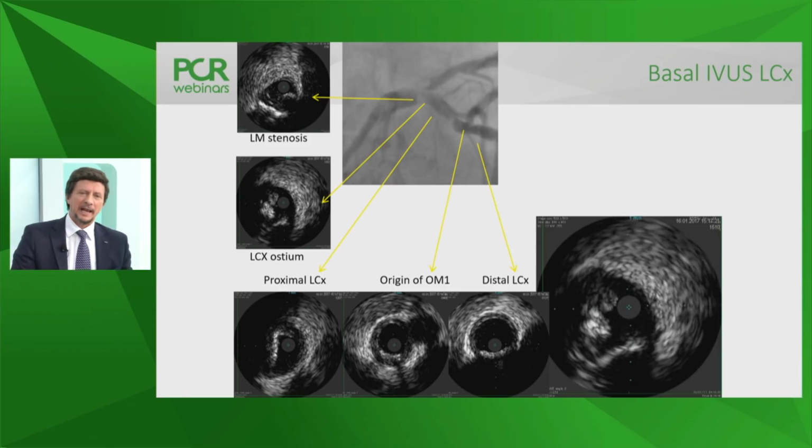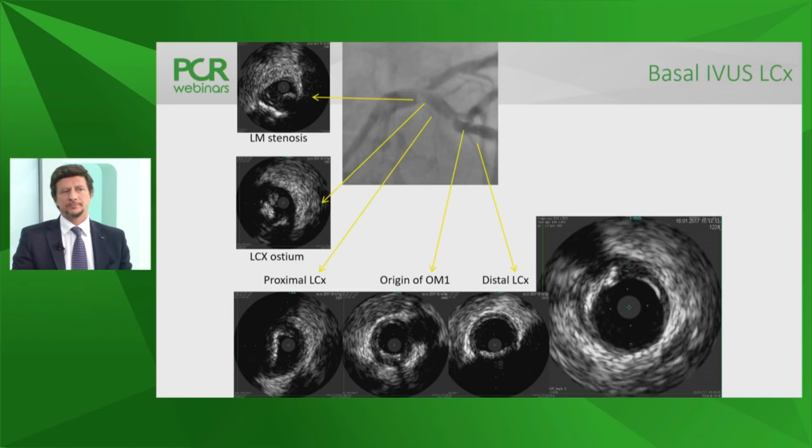We will very likely need to put 2 stents. And I am anticipating a little bit my opinion on how to deal with this bifurcation. And 2 stents, we all know, have a higher risk of thrombosis, a higher risk of restenosis. So the best we can do is to obtain the maximum expansion of the stents. And this is something you will obtain with a good lesion preparation.